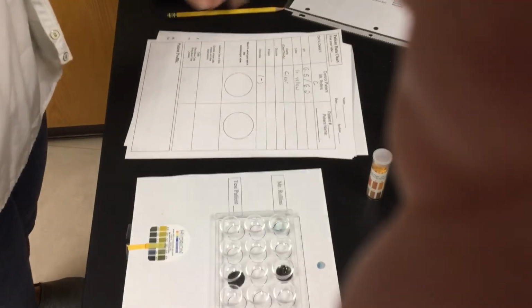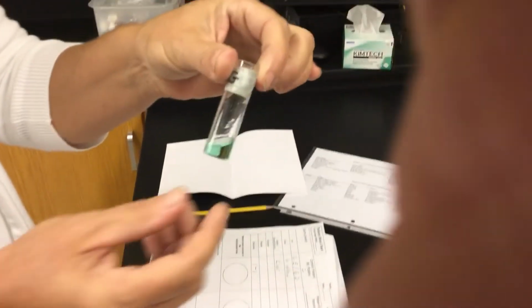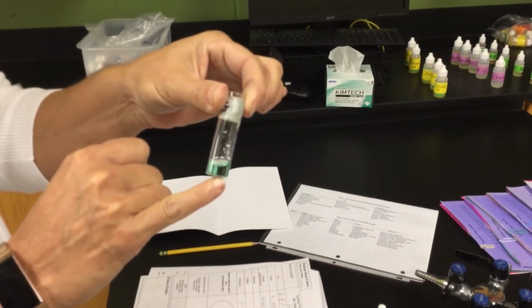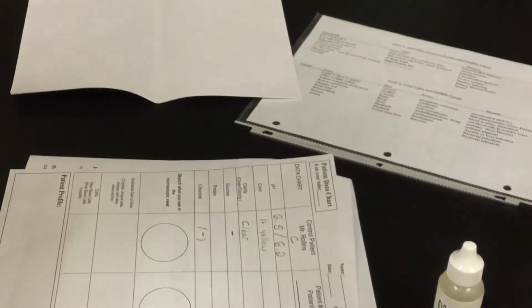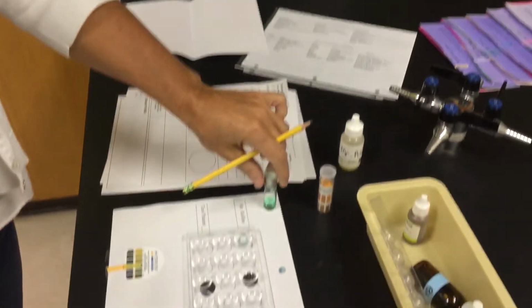I'm then going to go back. It should be about 5 minutes at this particular time. I would go through, I would pull my tube, and I would look at it. I would go up, coming off the heat. Mr. Rollins, he's still the same color as he was before. There's no color change there. So what I can say about that is there's no presence of glucose. So I'm going to put a negative there. Remember, he's our control patient, so we're not expecting any within him.